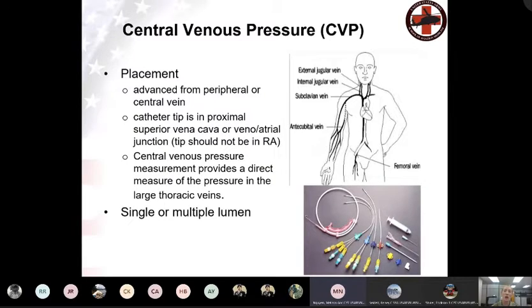Okay, exactly. So when we talk about a central line versus a peripheral line, the tip of that catheter is going to be somewhere different. A peripheral IV line, that catheter is only going to be about this long, and it's going to stay out here somewhere in the periphery. The unique piece about a central line is that the tip of that catheter is right outside our right atrium in our vena cava. So it's not necessarily that I put it in a neck or in my subclavian, because we can certainly have peripherally inserted central catheters, right? It's all about where the tip of that catheter is.